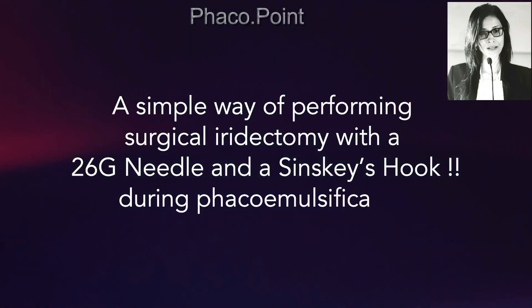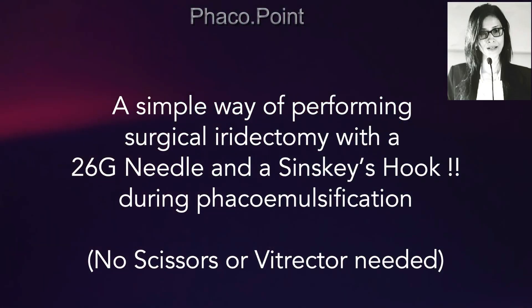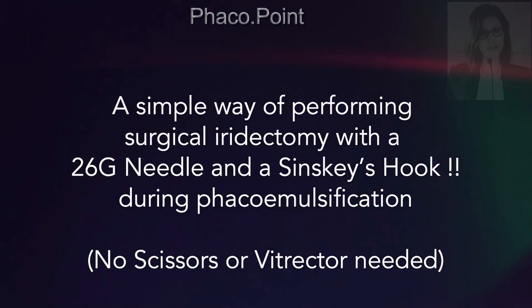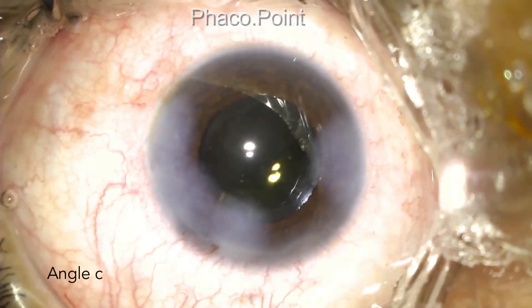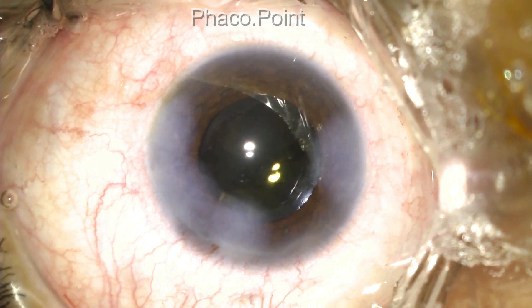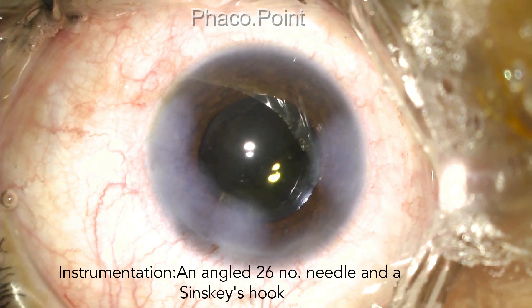In the following surgery, I'd like to share with you a very simple trick of performing a surgical iridectomy in a patient undergoing phacoemulsification without the use of scissors or a vitrector. This patient, with narrow occludable angles preoperatively, has undergone a successful uneventful phacoemulsification. We now proceed to perform the surgical iridectomy. The instrumentation required is nothing but an angled 26-gauge needle and a Sinskey's hook.